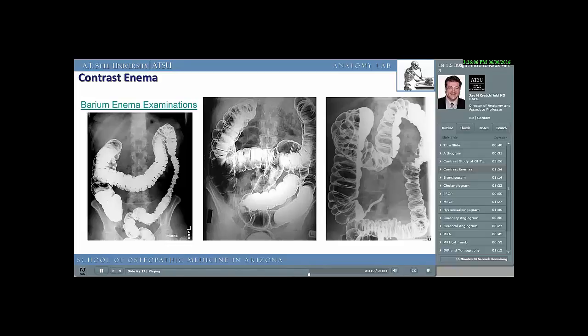Therefore, if your patient is under consideration for an operation on the abdomen, it's best to use gastrographin studies rather than barium sulfate, as it's easier and safer for the body to evacuate the gastrographin, and it will not cause an intense inflammatory response. Even though gastrographin contains iodine, it will not elicit an allergic reaction if a patient claims an allergy to iodine, since by giving this chemical into the GI tract, it's not absorbed. It's considered giving it, quote, external, end quote, to the body.